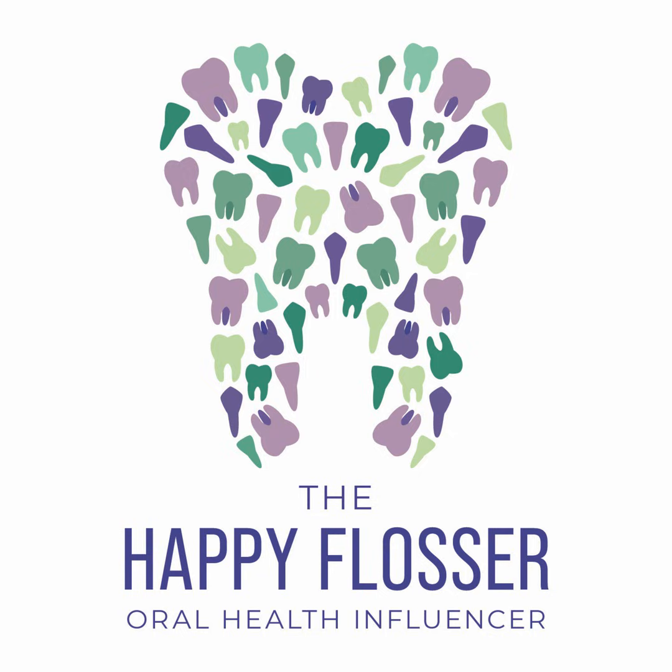You want to look at all the areas on those radiographs and look for patterns. And the other thing that's great, if available, is to review the previous radiograph if there's a comparison. But you should never look at the previous radiographs when you are evaluating the current radiographs. You want to review them after, so you don't have a biased look at these radiographs. You want to have a fresh set of eyes.